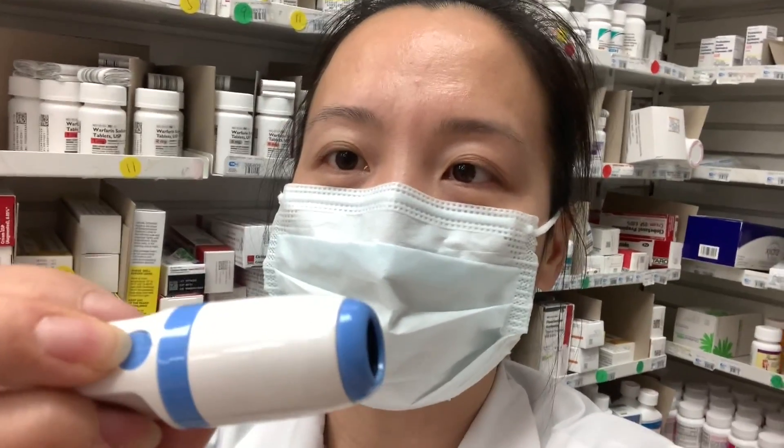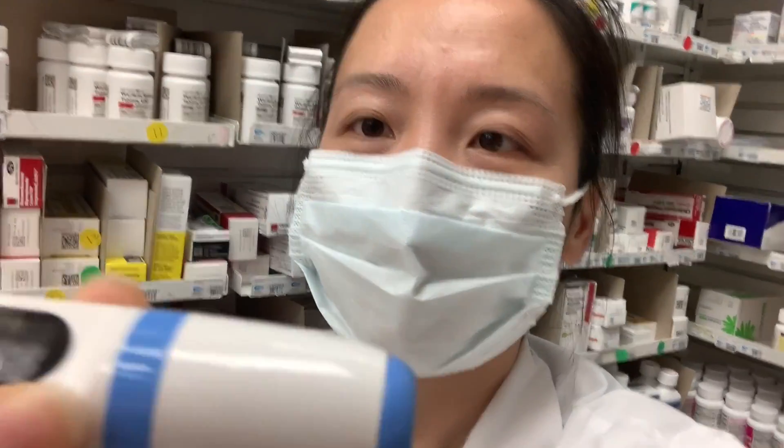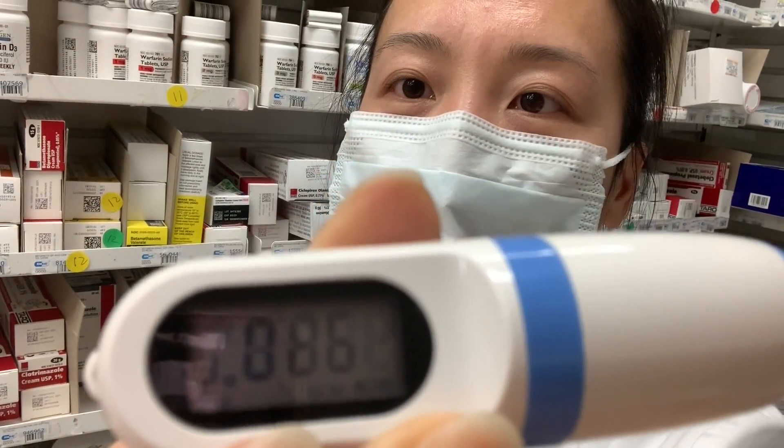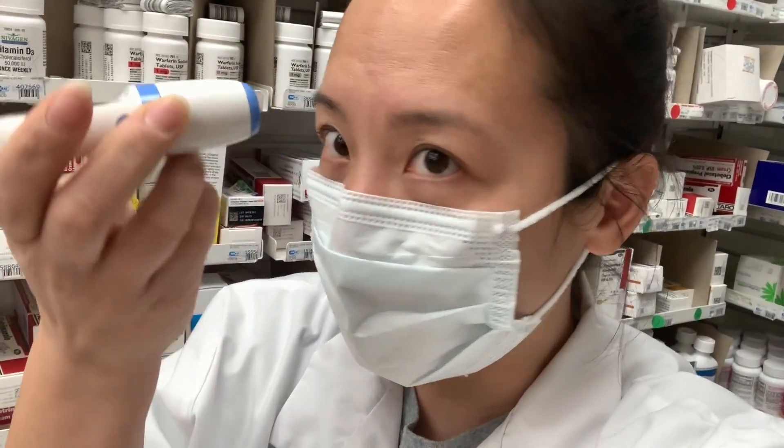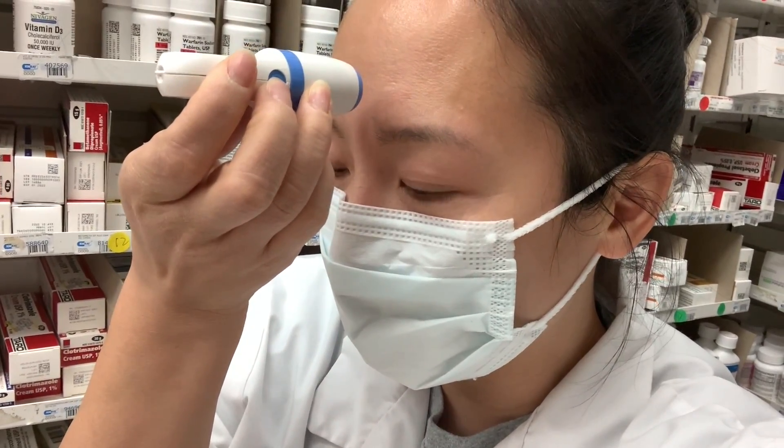All you need to do is turn this button on. It says 'low.' So go against your forehead, not really touching it, and press one time.